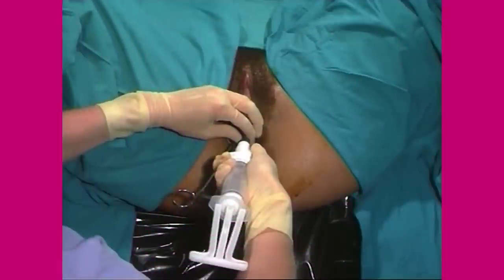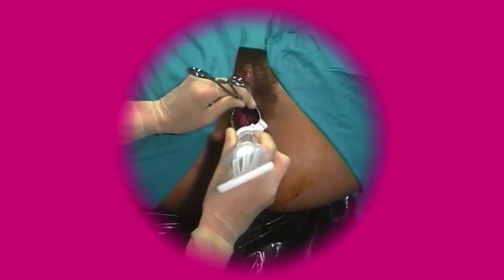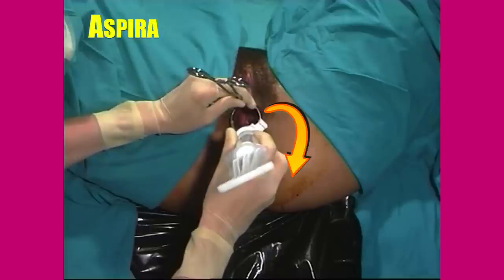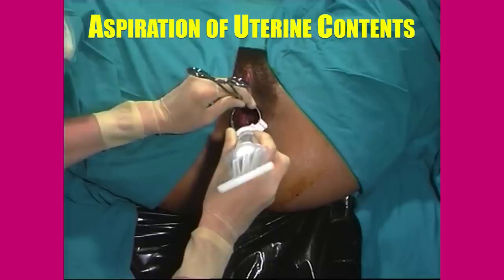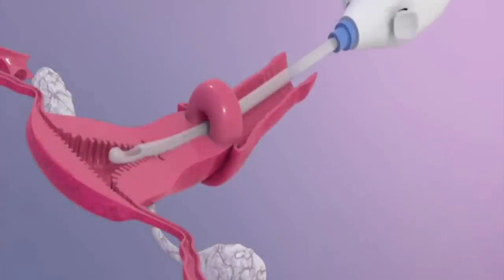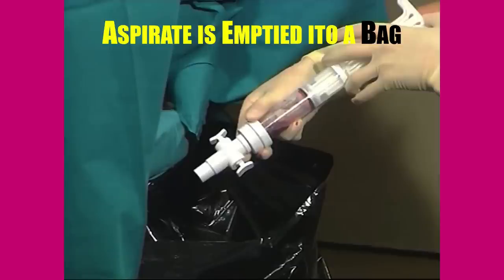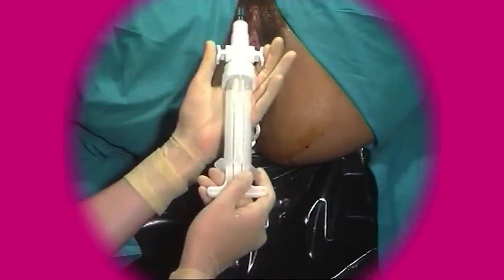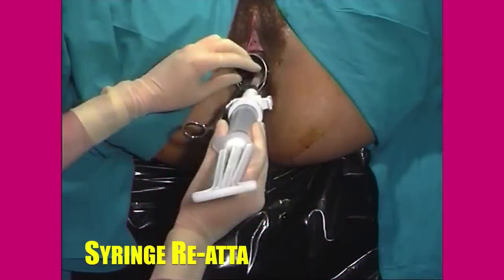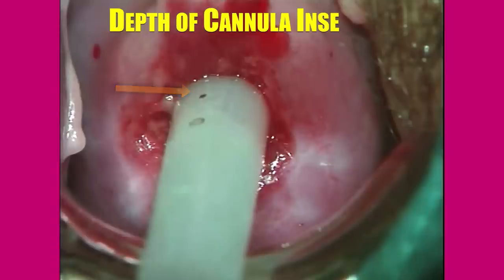After connecting the syringe to the cannula, the pinch valves are opened so that the vacuum is transmitted to the uterine cavity. Then, by doing back-and-forth and rotating movements, the uterine contents are aspirated. The MVA syringe must always be held at the barrel and not at the plunger — see the following animation. When the vacuum becomes insufficient, the syringe is disconnected and the contents emptied into a disposable plastic bag. The detached syringe is then recharged — that is, vacuum recreated — and reconnected to the cannula and the procedure resumed. The centimeter markings on the plastic cannula help the operator to determine how deep the cannula can be inserted safely without causing perforation.